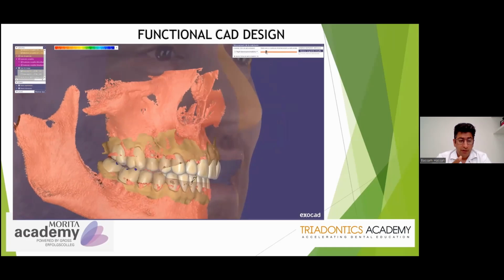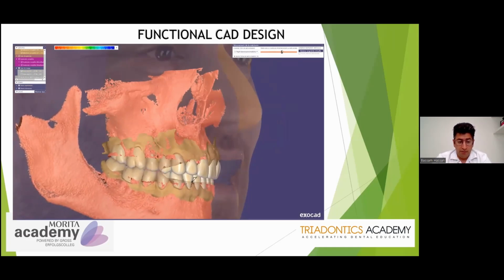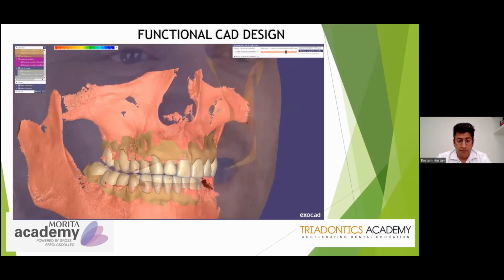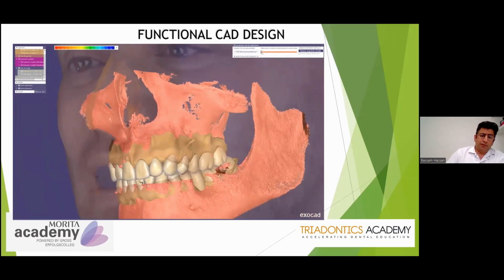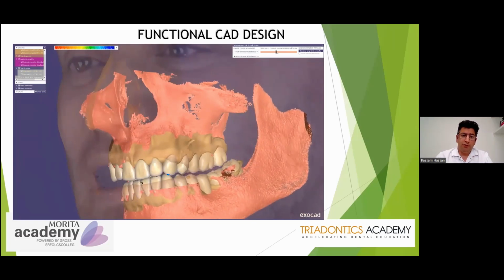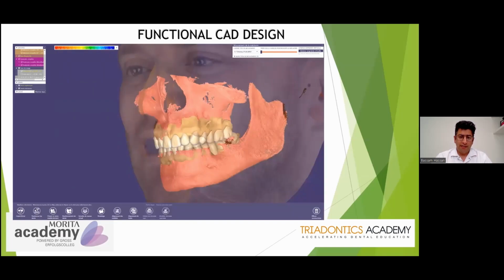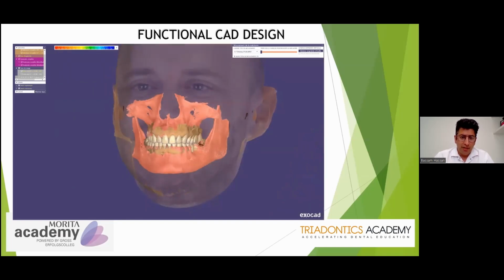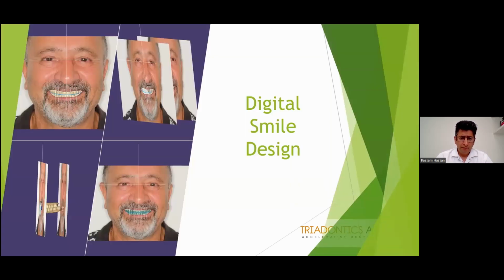The cone beam would give you an indication about the morphology of the roots. And of course, we had an implant here at position 3-6. What I'm saying is that when we started doing full arch rehabilitations, the first thing we did were, let's say, the dentulous cases, not the edentulous cases, cases like these.